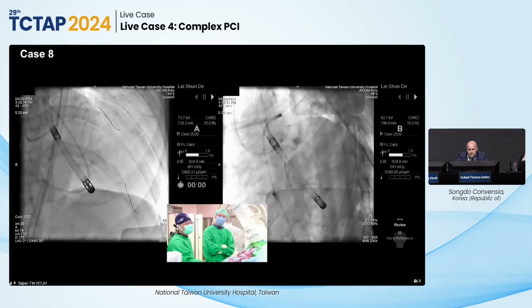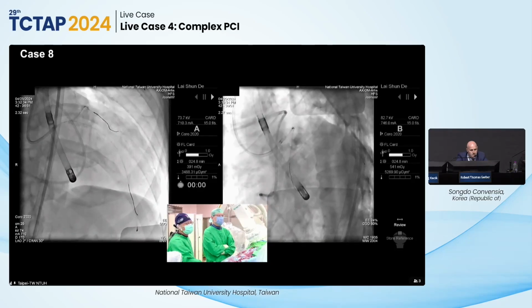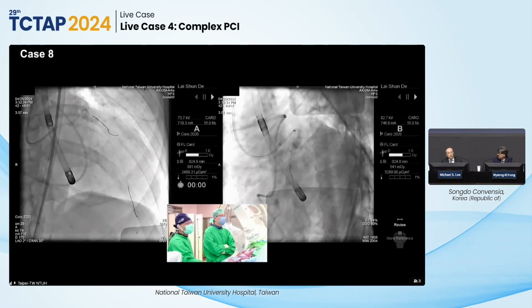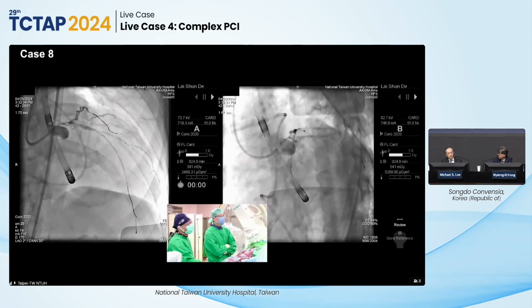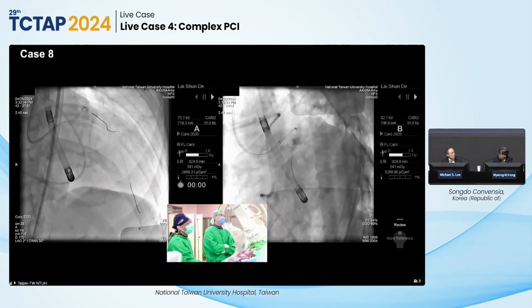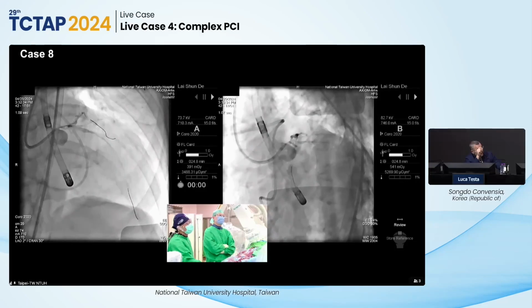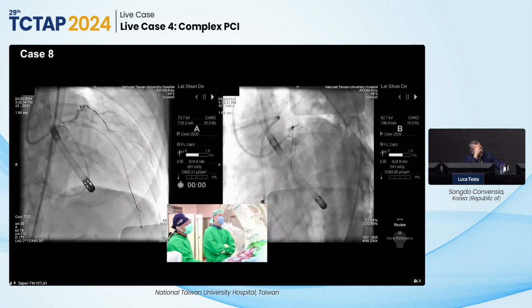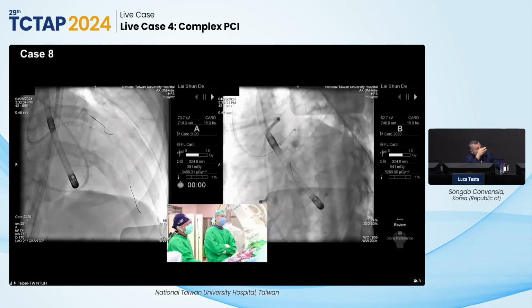I think there is also another consideration we should make. If you look at the blush of this artery, especially the LAD looks really sclerotic. It's not obviously a confirmation, but at least a signal that probably that wall is going to be dead. So in other words, I will not spend a lot of stents there. I totally agree with this keep-it-simple strategy.